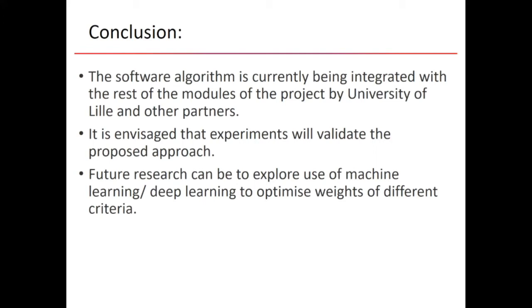And also, obviously, the ultimate aim is to minimize the limitation of having to rely on the seed plan made for straight needles, where the planning takes into consideration the limitations of straight needles. So if we manage to have the plan for our type of needle in the first place, obviously this would improve tremendously the performance of the algorithm itself.